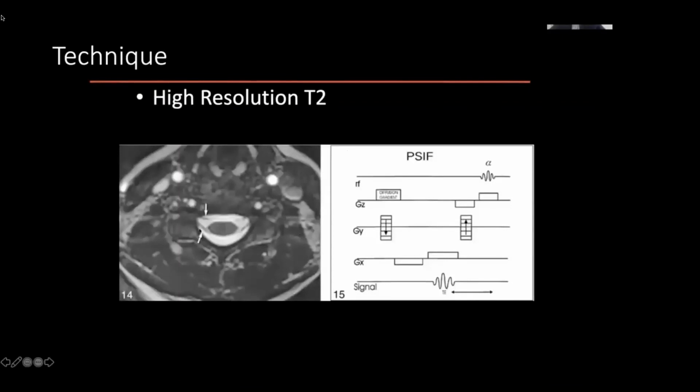So with high resolution, instead of using MRI sequences that cut through individual sections only, we're now able to acquire entire volumes of tissue, which is what we call a 3D sequence. Then you can take that volume of tissue and cut through it in any plane you like. Doing this with these volumes of tissue also allows a much higher resolution evaluation, so you're able to see much smaller structures, including, as I said, the neural foramen.